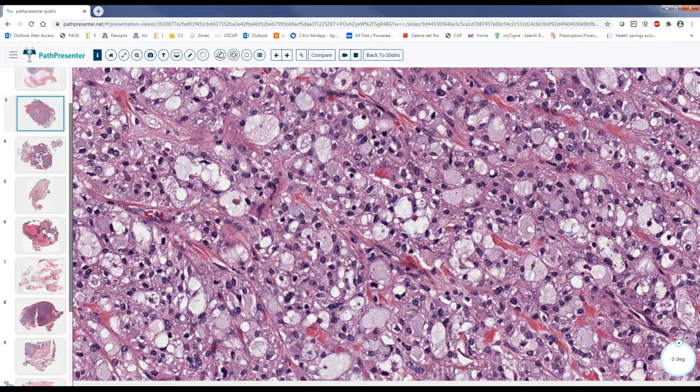So usually proteinaceous, secretory material. It is not that significant, but it's good to know that this material is not, for example, other secretion that may be specific for other lesions, like alpha-fetoprotein material in germ cell tumors and so on. I don't want to discuss that.